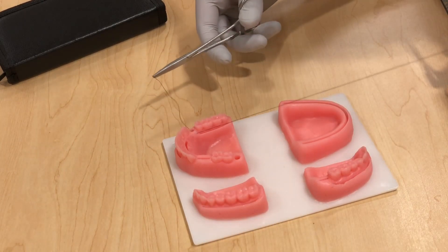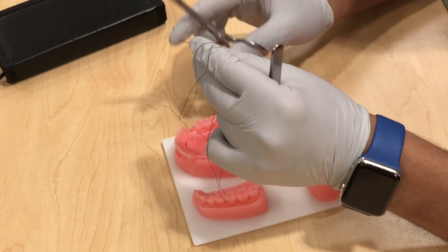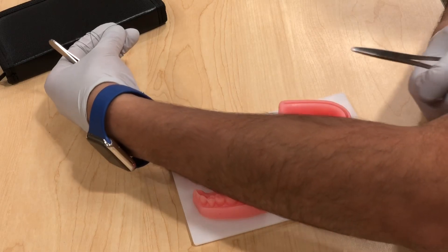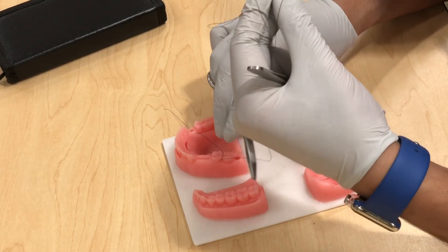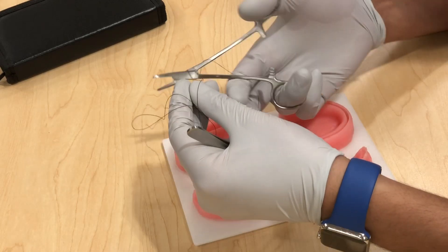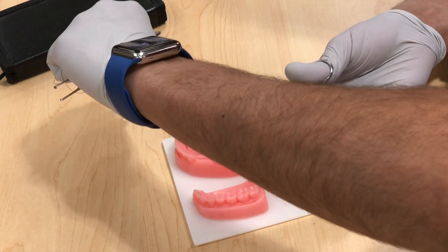Hold it to not lose it, keep about an inch, and try to keep the needle in your hand so you don't lose it and it doesn't hurt anyone. Always do your loops toward the short end and then tighten the knot on the opposite side. Start with a two-loop — you need enough distance, about two palms. Do your first loop, second loop, then open, grasp the tip of the short tail, and tighten in the opposite direction.